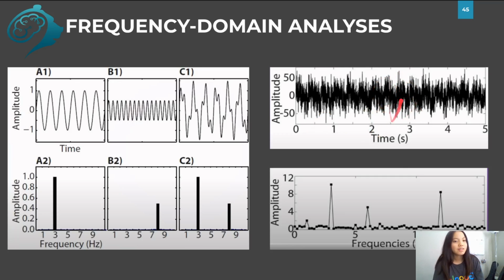So this looks like a very complex and noisy signal, so it's difficult to identify how many different components are in this signal in the time domain, but in the frequency domain it's much easier. So we can see that there's around 1, 2, 3, 4 sine wave components of this signal, plus some low amplitude broadband noise in here. So it's easier to talk about this signal in terms of the frequency domain. And you will learn how to get to the frequency domain in the next section using a famous signal processing method called Fourier transform.